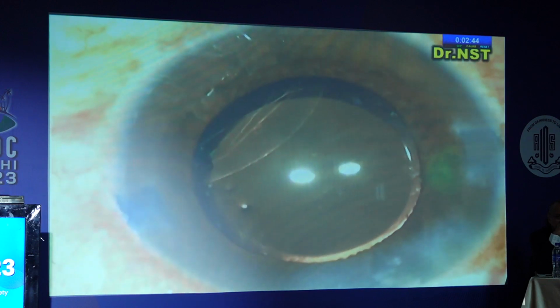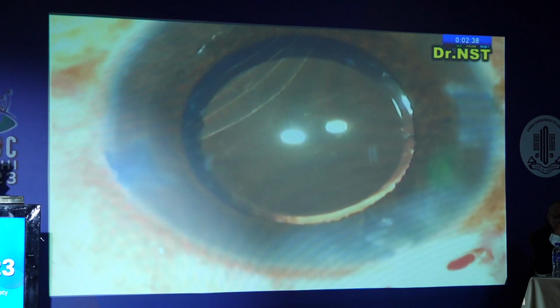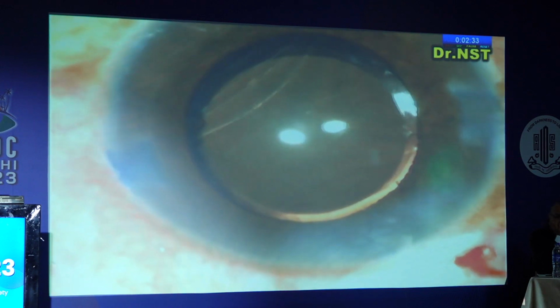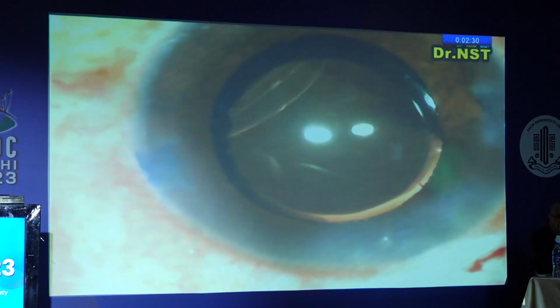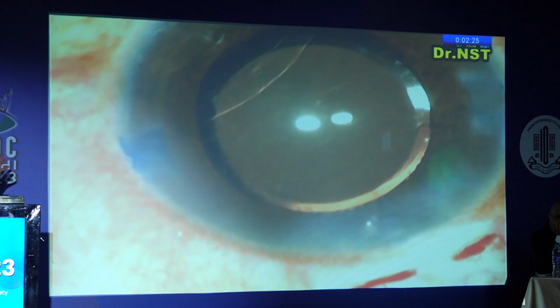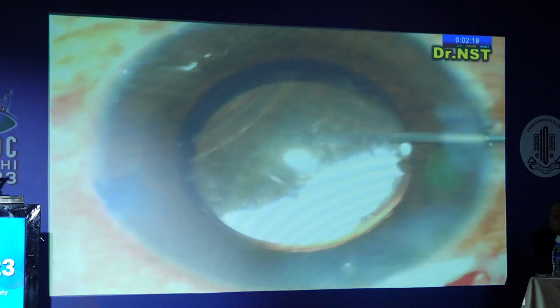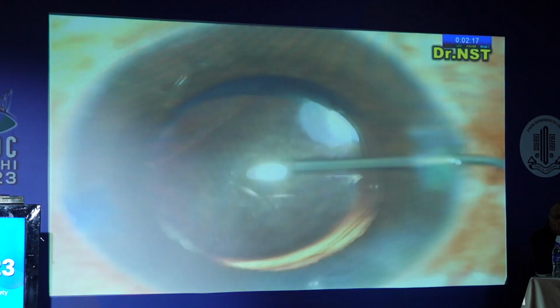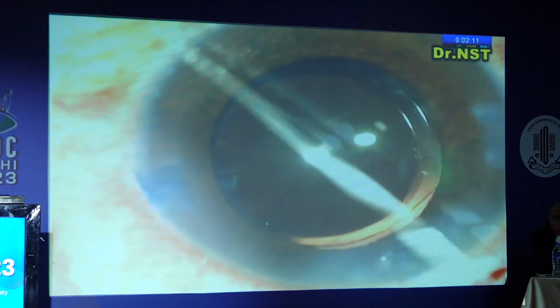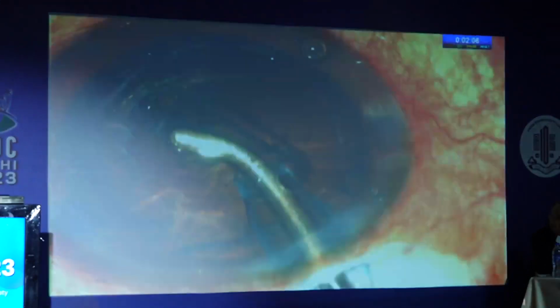I don't know what to do at that point. And just keep patience quietly. Suppose immediately we start thinking of CTR, this thing, that thing. A very simple trick I thought of: just put the fluid in the anterior chamber, make the chamber normal, and just put the fluid towards the direction of the back and it gets settled. That's all. So anytime anything can happen, and then with the tense eyeball, everything went back and the thing has finished.